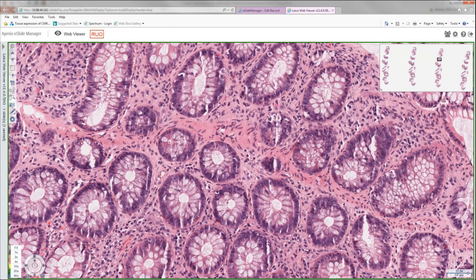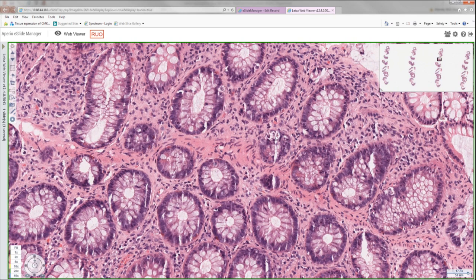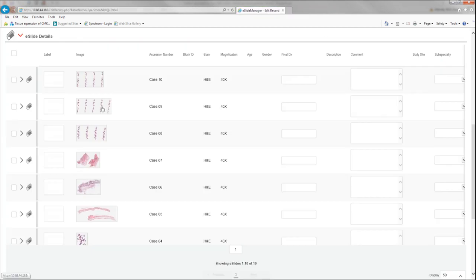This was throughout the biopsy, so these are apoptotic bodies. A clear halo is characteristic, and it helps us identify this even from the low power, with fragmentation of nuclei particles included in that halo. Other than that, there wasn't much intraepithelial lymphocytosis, and as I mentioned, the lamina propria was pretty intact.